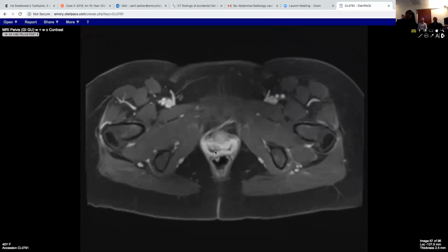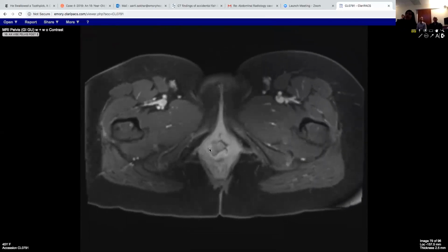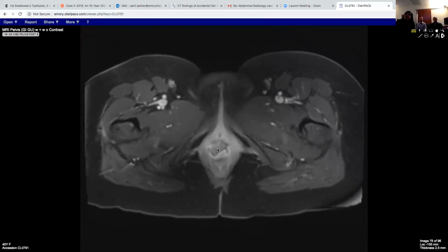Here's the post-contrast. So some of this is sort of a large ulcerated mass, and there's also an exophytic component coming off here. So this part did not have as much T1 signal, whereas this area did. So again, it might be melanin, or it might be some hemorrhage within it. So basically, it ended up being melanoma.